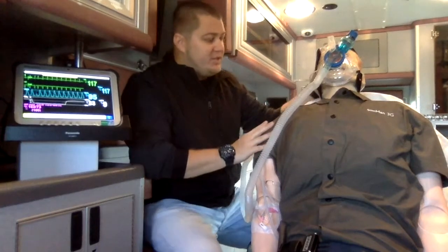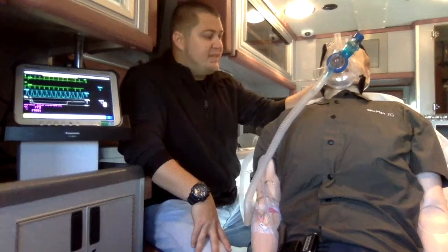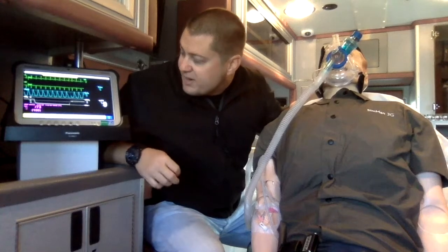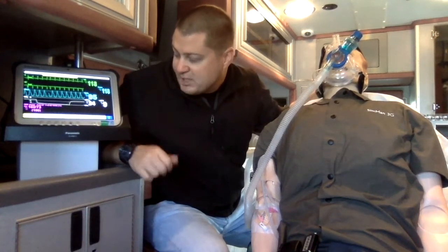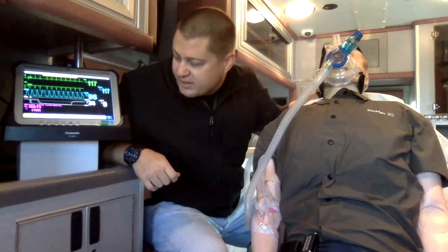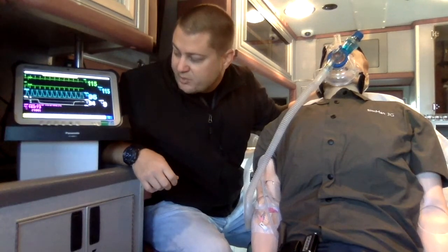We're going to leave this individual in a high Fowler's position because I do believe it's CHF exacerbation. I don't want to worsen that until I absolutely have to. Rechecking vitals here. Heart rate's down a little bit, we're in the 118s, still sinus tach on the monitor. SpO2 has improved drastically, all the way up to 95%. EtCO2 is at 36, again with no airway restriction noted. And blood pressure is 153/73.